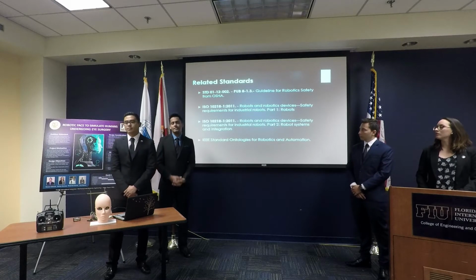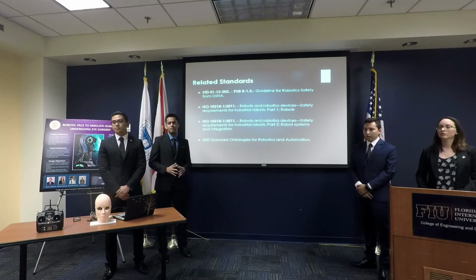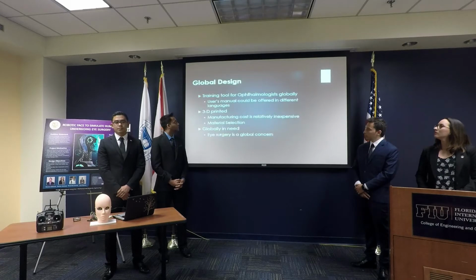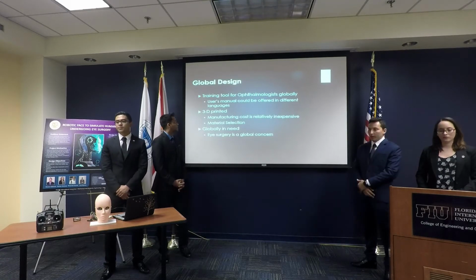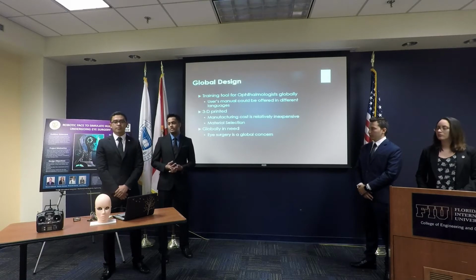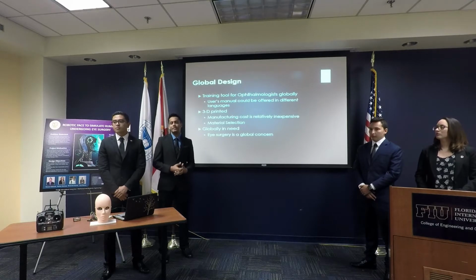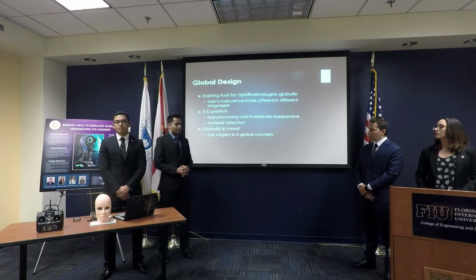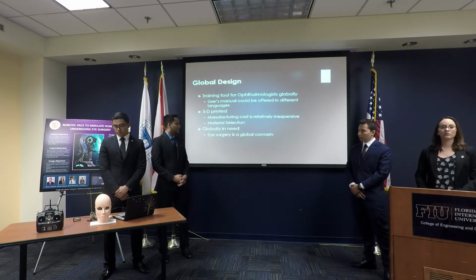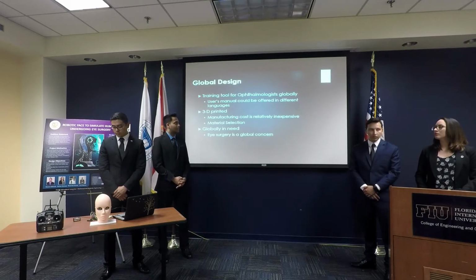These are the related standards we used. Some of them are from a health and safety standpoint, and the others are from a robotic standpoint. Our project has a lot of global design implications. It's a training tool for ophthalmologists globally because once our design is up, anyone around the globe with a decent 3D printer can access our design and add the servo motors, and it's almost ready to go. The manufacturing cost is inexpensive, and overall eye surgery is a global concern, and we're glad we're able to help them.